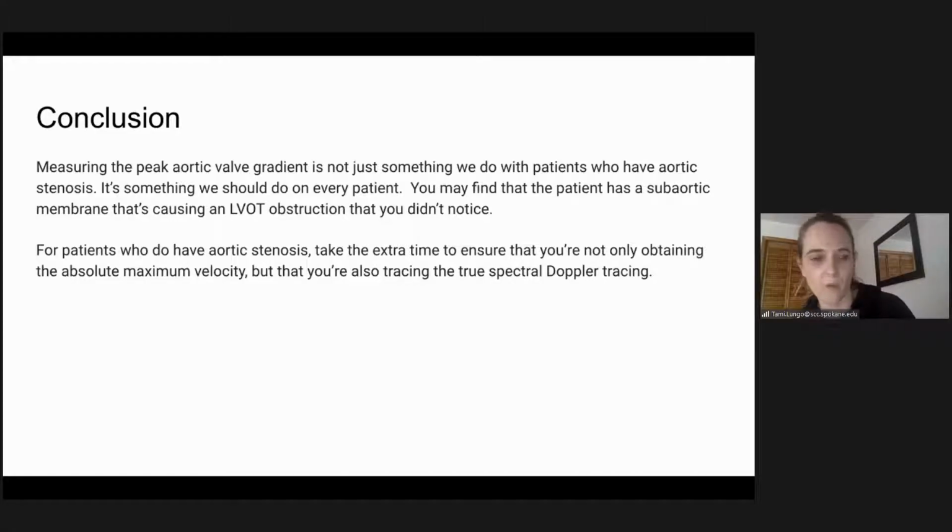If it's before the valve, what's causing that before the valve? If it's not a stenotic valve, then why is there a step up? It's probably some type of membrane. So it's just pretty much saying drop that CW. And it's okay as a sonographer if you don't see something initially and then you see it, to go back and then say zoom in on a parasternal long to try and find that membrane.